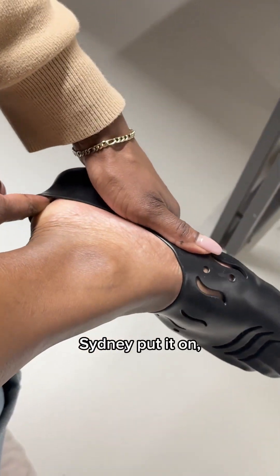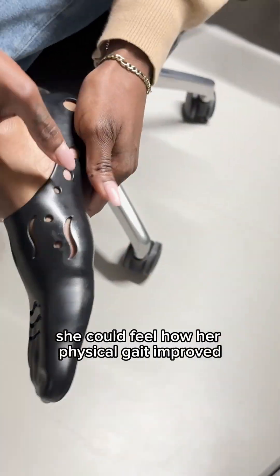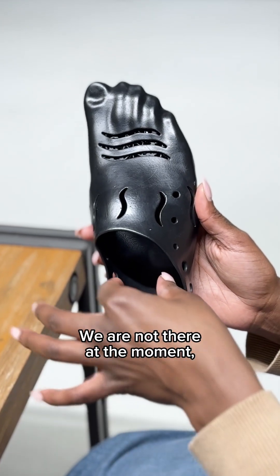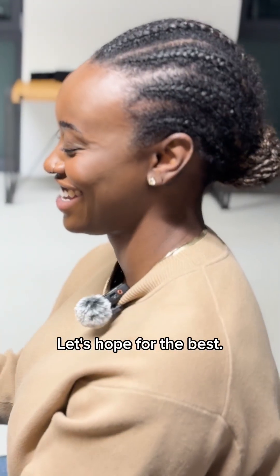And then came the moment. Sydney put it on and said that for the first time in 20 years, she could feel how her physical gait improved and how walking felt more natural again. It was incredibly emotional, even though we know it's not a perfect fit yet. We are not there at the moment, but maybe Prototype 4 will get us even closer. Let's hope for the best.